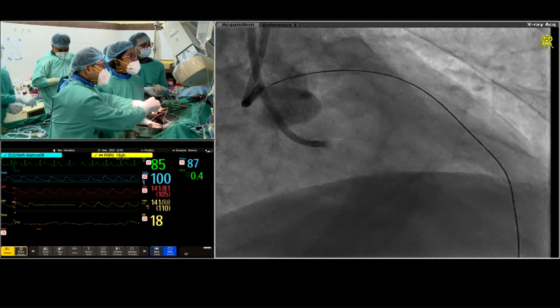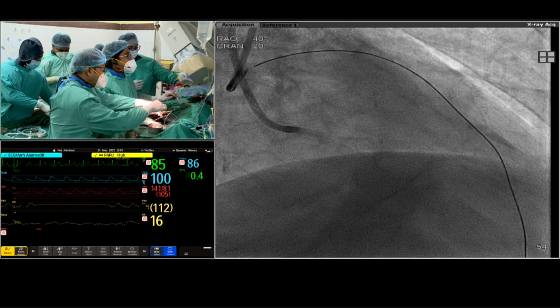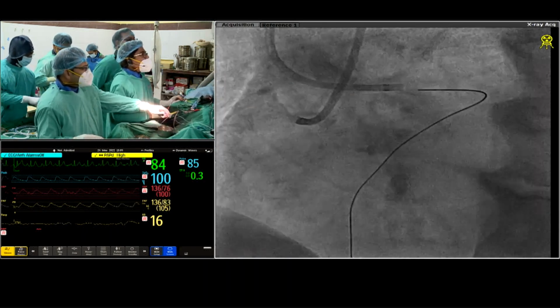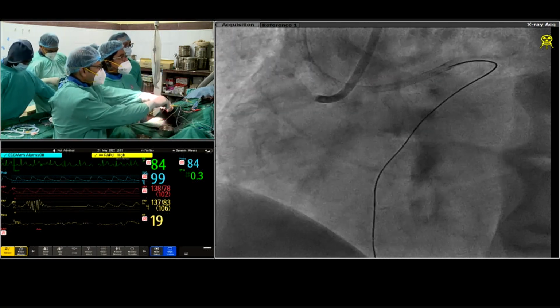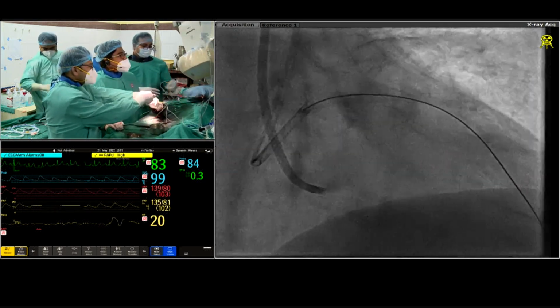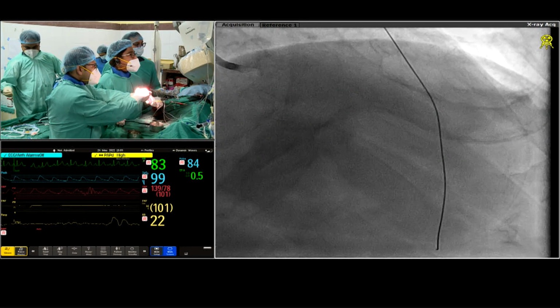Come on. 1 minute. LAO please. Just hold on. Back to RAO cranial. Come on.